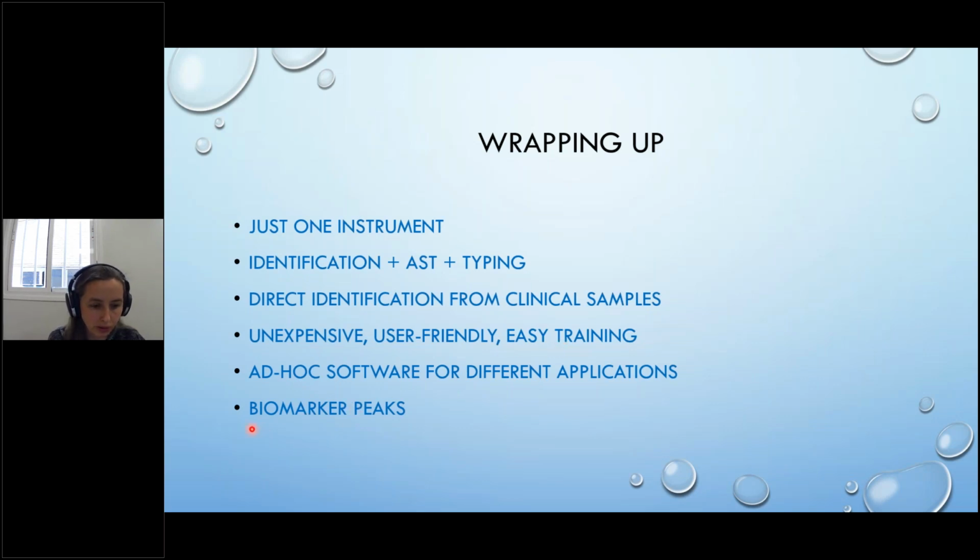And then most probably biomarker peaks for different important groups of bacteria will be developed too, and that will make things easier in the laboratory in the future.